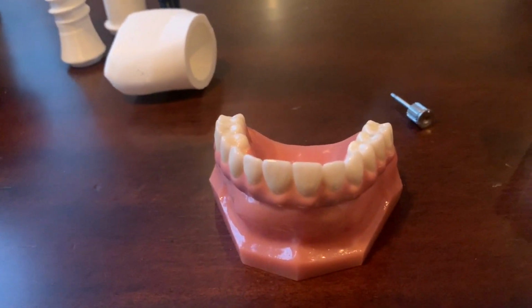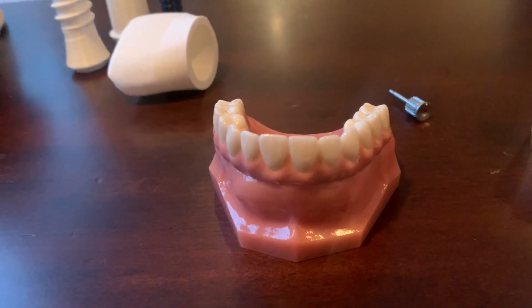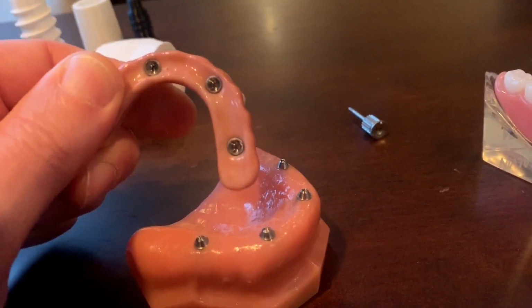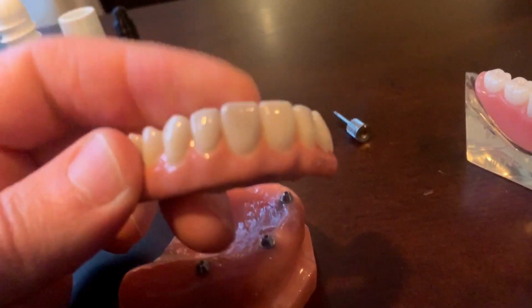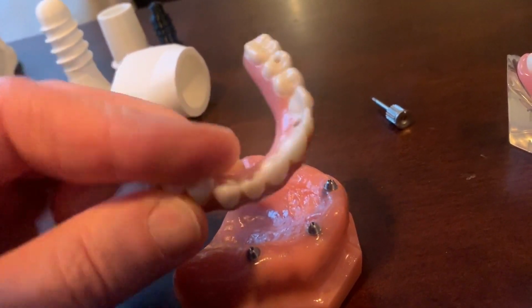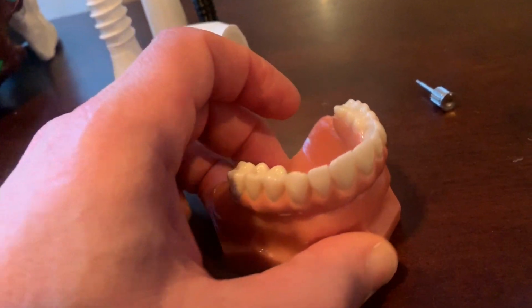So for people that are missing all their teeth and have been missing teeth for periods of time, and they're missing gum and bone, these 2 options are going to come down to the best bet: the full mouth implant bridge or the removable denture. Do want to point out one other thing here. This bridge, it's a lot thinner. Some of my patients don't end up getting nearly quite as much pink gum tissue if they haven't been missing a lot of bone. Sometimes people are like, well, geez, that still looks like a denture, and do I really have to have all that? The bottom line is we only have to replace what the person is missing.